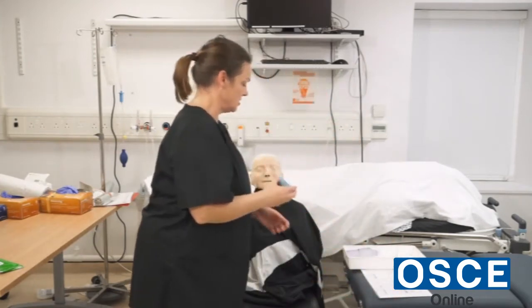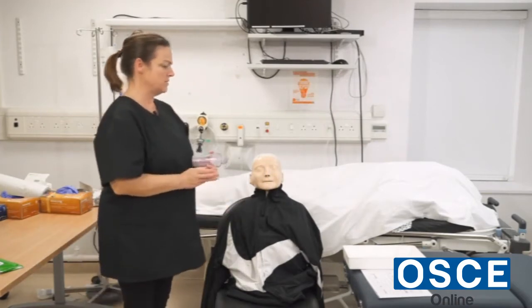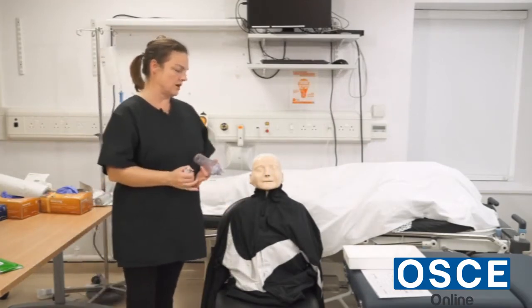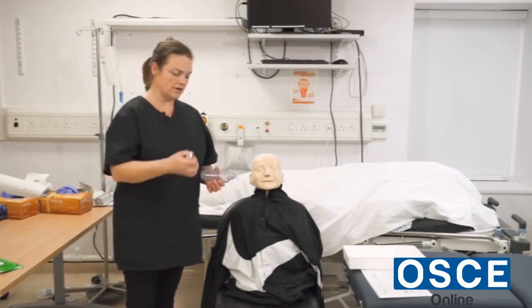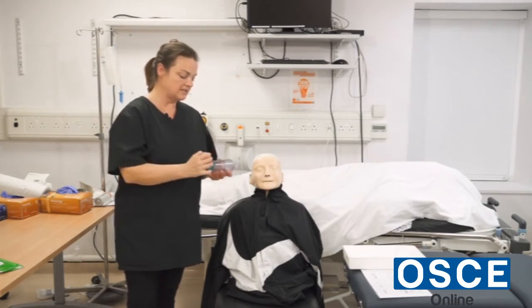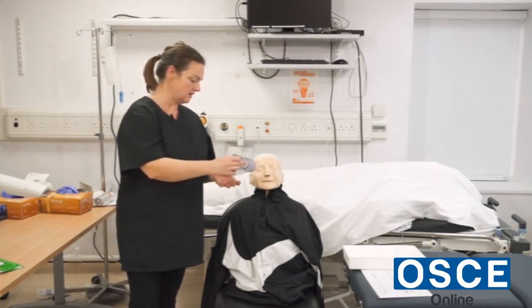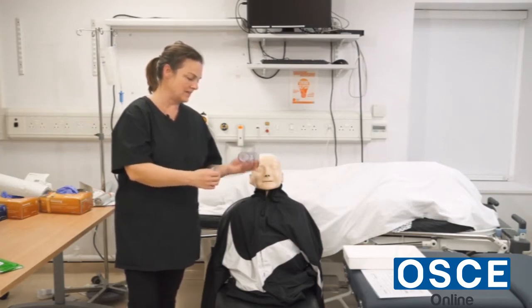So I'm just going to ask you to follow these instructions. So what I would like you to do is, again, sit up straight, breathe out, and I'm going to take this inhaler, shake it, put it into the handheld spacer device, ask you to grip it between your teeth and lips.